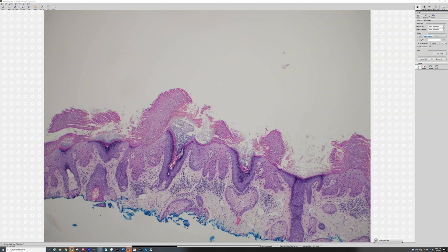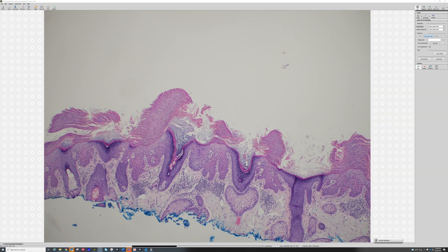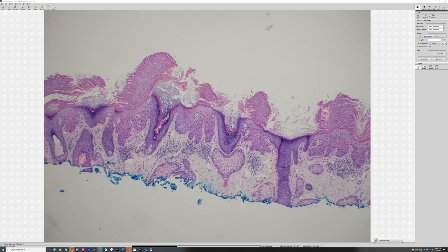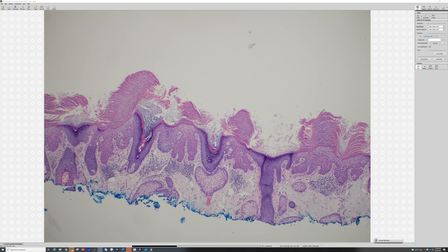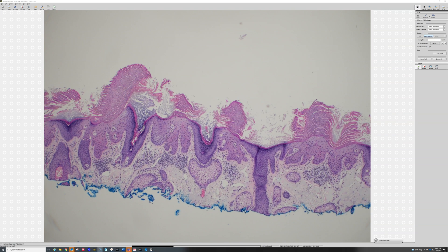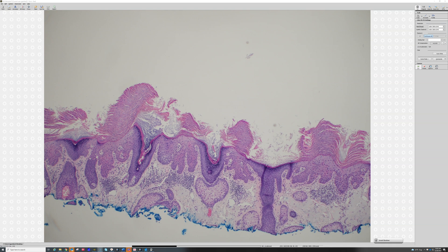I would call this a hypertrophic actinic keratosis because it's thick. Some people would also say hyperkeratotic — I kind of lump those two terms together, even though technically they are different things. Hyperkeratotic means the corneal layer is thick; hypertrophic means the epidermis is thick. In all honesty it's probably more like hyperplasia rather than hypertrophy, but I would call this a hypertrophic actinic keratosis. And this is the flag sign — if you've got a good imagination, this looks like a flag.